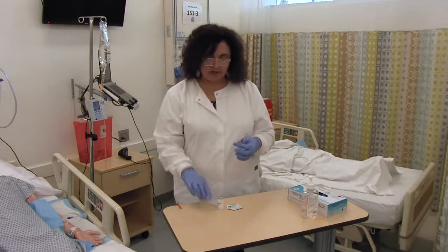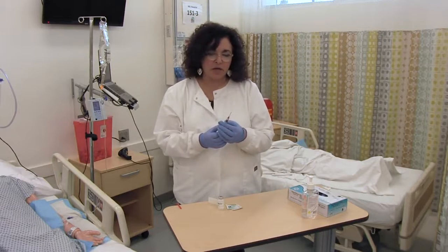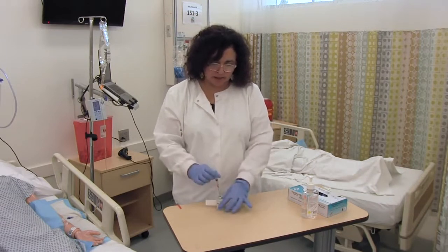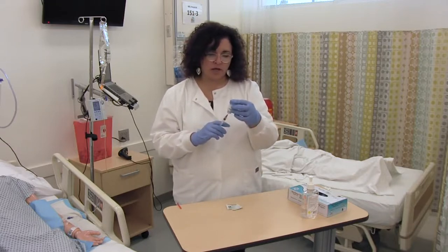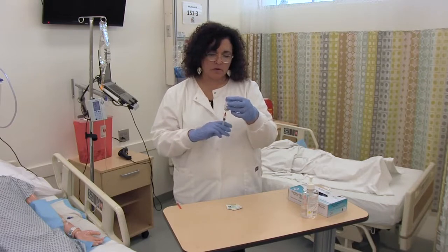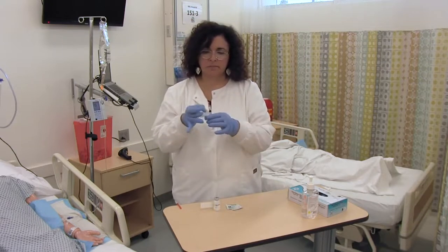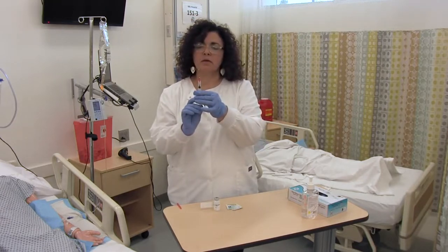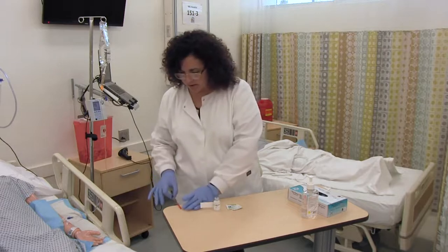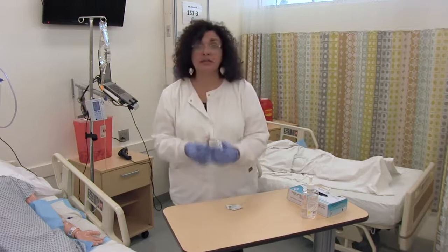My med math is very straightforward here, 30 milligrams per milliliter, and I have a 30 milligram dose. So I know that I will be pulling up 1 milliliter, air first, and then withdraw your 1 milliliter. Okay, I have 1 ml. I scoop up my cap, and now I need to do check 3.